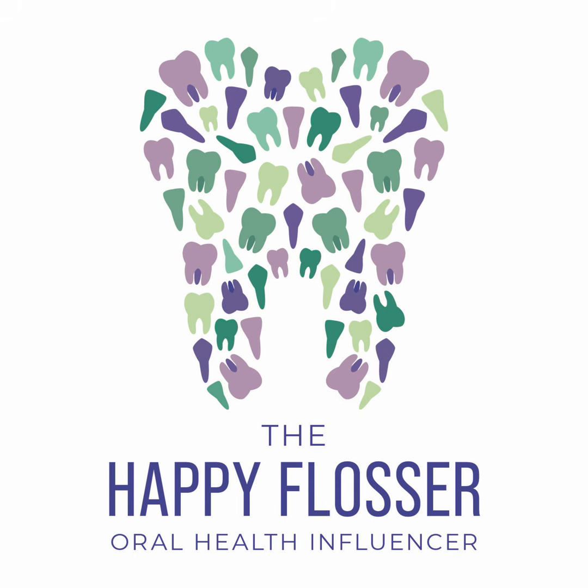A second example would be a patient who comes in and they explain to you that they have pain on their upper front tooth. They have fallen and it is fractured. Nowhere else in the mouth are there any carious lesions, no large restorations, and the tissue appears healthy. The patient recently had their wisdom teeth out about 6 months ago. So what would we take for radiographs?